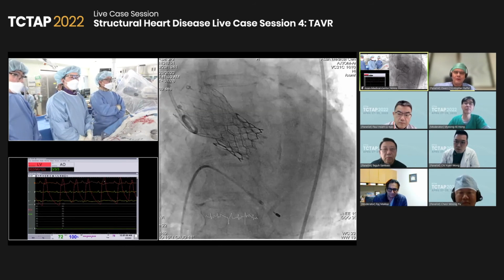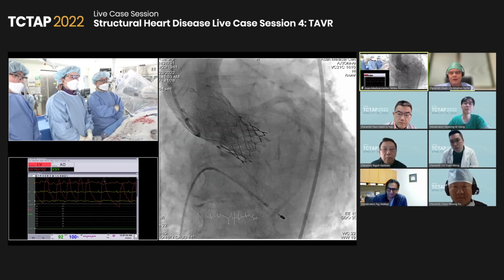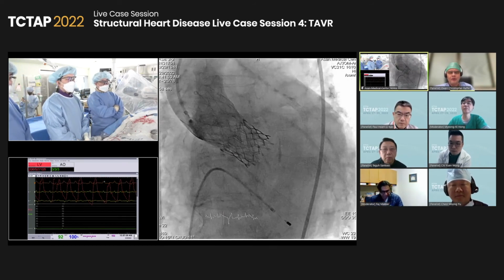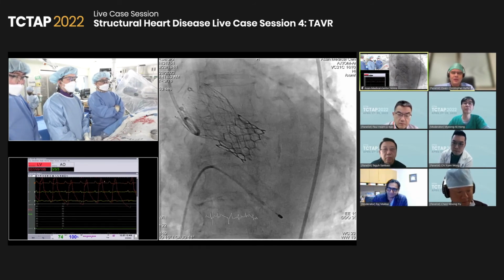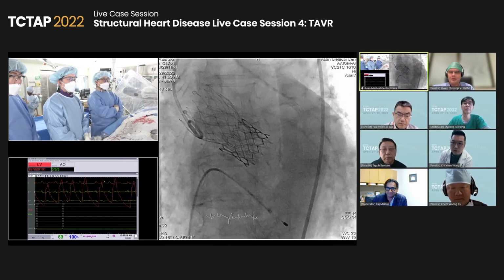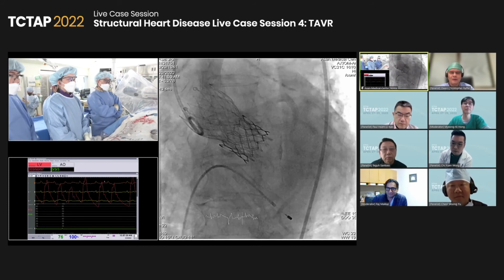You don't want this valve to fail. It is a surprise that the first SAPIEN did fail. Yeah. And we've got plenty of 23s and they don't fail. And in the absence of severe renal impairment or dialysis, it is unusual. But I certainly agree. I think good anticoagulation and close monitoring.